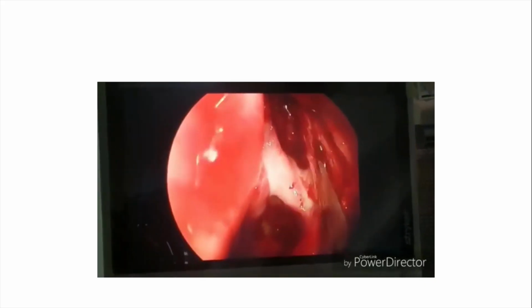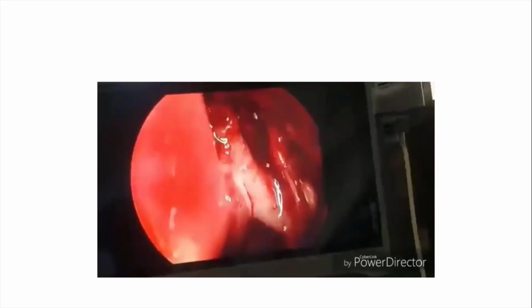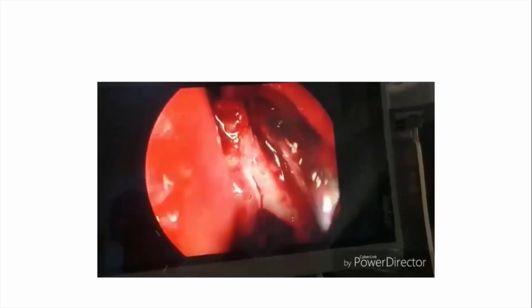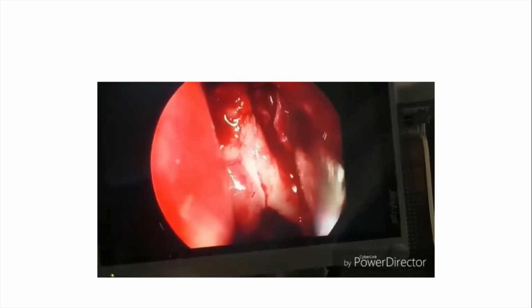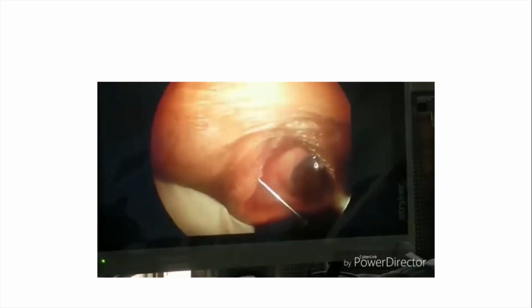One is the pus, I think pus came out. Now they're entering into the sac and releasing the medial flap and lateral flap. So this flap, you have to remove it out totally. You got the point? So now on the sac, we will again do the incision, probing and the flap.